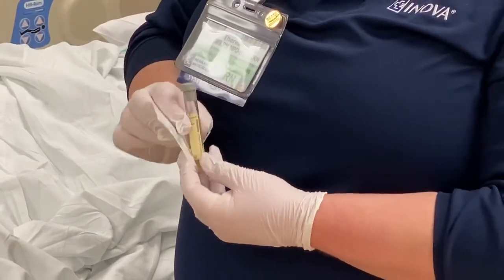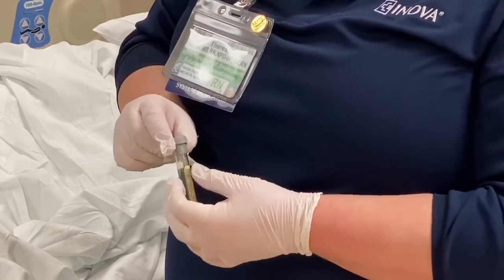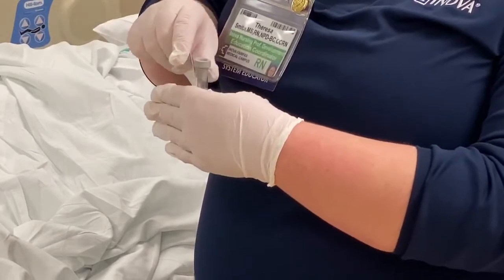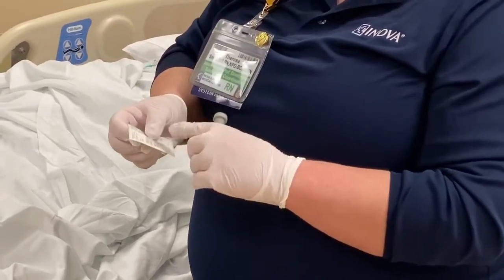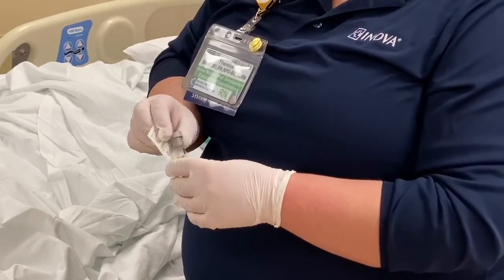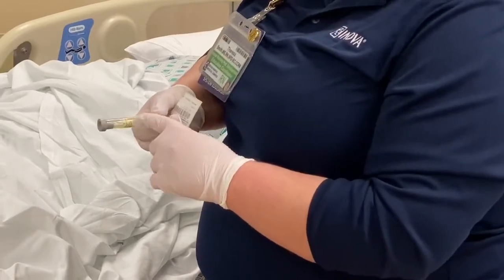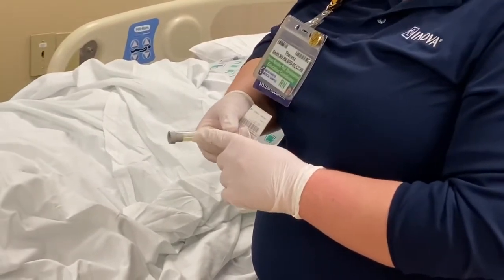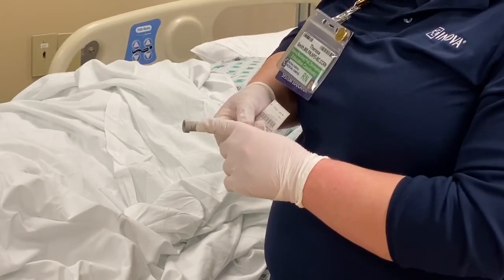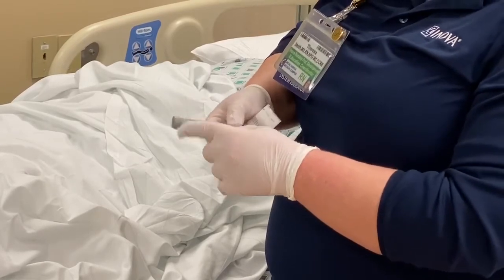So this gray tube is pretty short. When it goes down to the lab, they're going to need to make sure they can see the patient's name when they put it in their machine that runs the test. So I need to get this label as close to the top of the tube as I can, okay? So normally when you label tubes, you are going to match your label up with the manufacturer's label on the tube. For this gray tube, I'm actually going to line my label closer to the top. And I also want to make sure that my patient's name is close to the top.